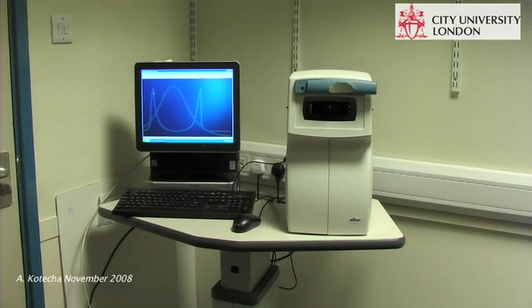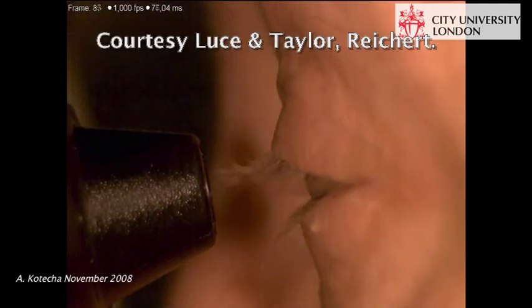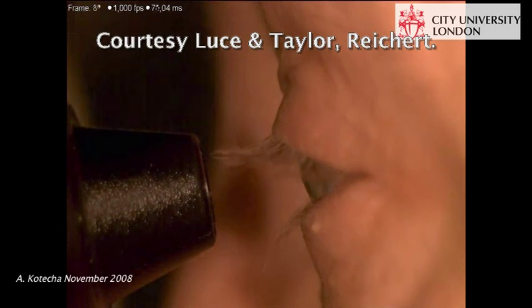The Reichert Ocular Response Analyzer, or ORA, is based on the non-contact tonometer. It measures the corneal response to a rapid jet of air. The ORA gives a measure of the corneal biomechanical response. This will be discussed further in your lectures.